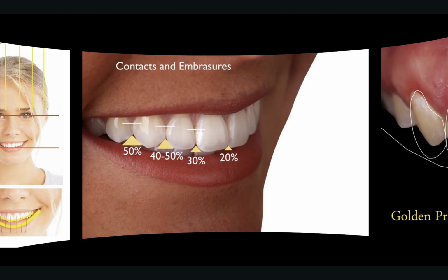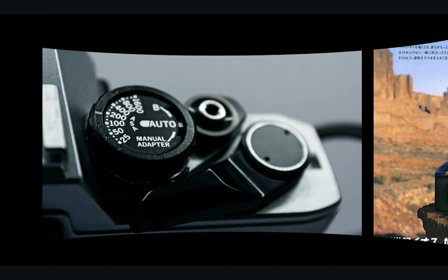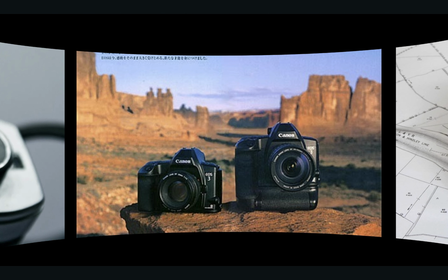The widespread use of digital photography and the access to affordable cameras revolutionized the way that dentistry could be documented and recorded. Patients were able to be photographed and you were able to check photos then and there, rather than having to wait and see whether or not, after developing them, they were actually usable photographs. And only to realize that actually they weren't diagnostic, and wasting more time having to retake them. It was expensive as well to develop photos.